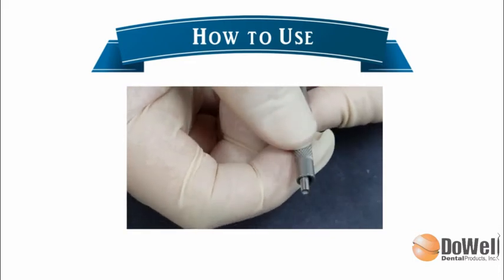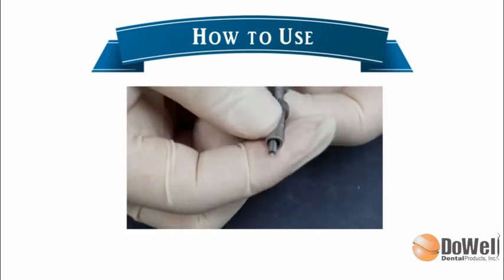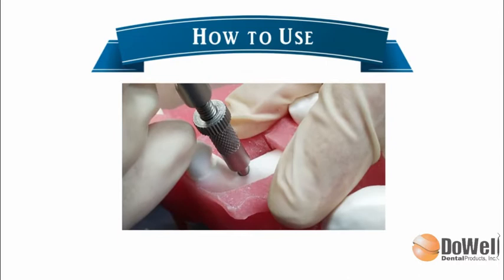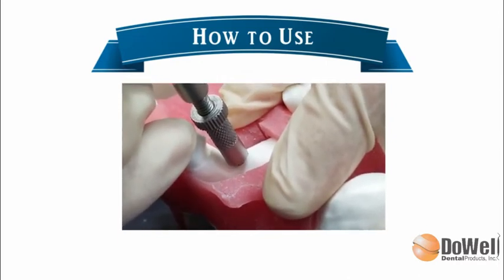The first video is a demonstration for the stopper, which can be adjusted with the use of 2 screws. Measure the stopper and tap in the pre-drilled position to break sinus crestal walls. This is the Summers technique.